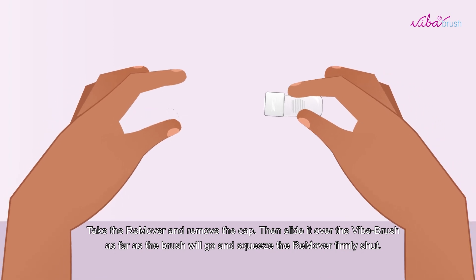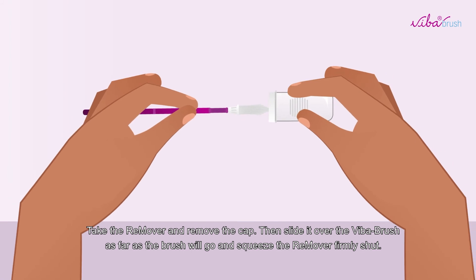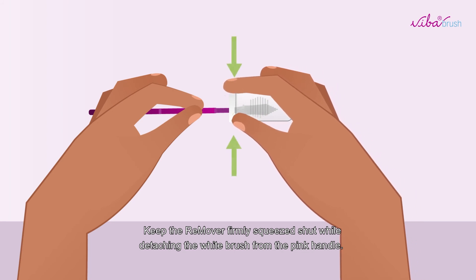Take the remover and remove the cap, then slide it over the Viber Brush as far as the brush will go and squeeze the remover firmly shut. Keep the remover firmly squeezed shut while detaching the white brush from the pink handle.